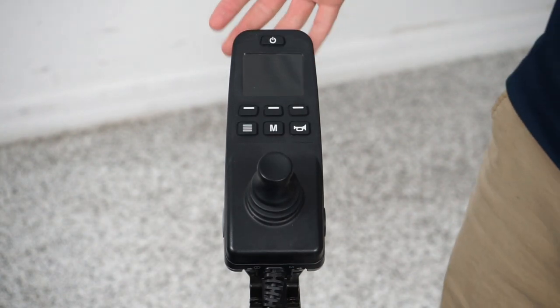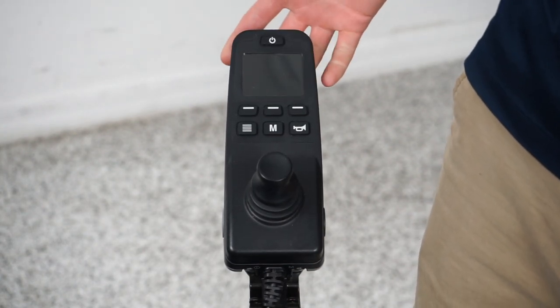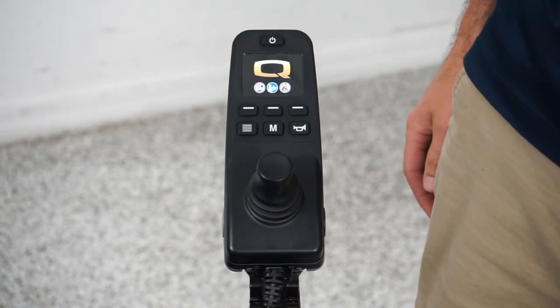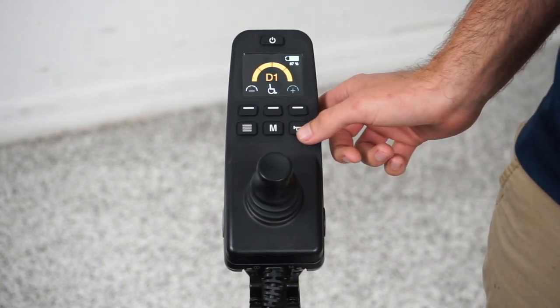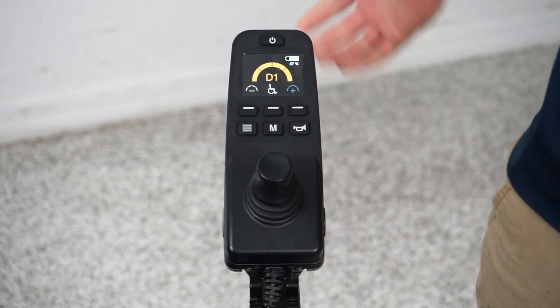I'm going to start with the simplest buttons. The first is the power button — all this will do is turn the chair on and off. The next button is the horn button, which controls your horn. That's all it does.